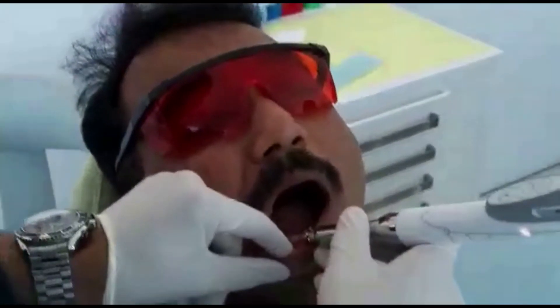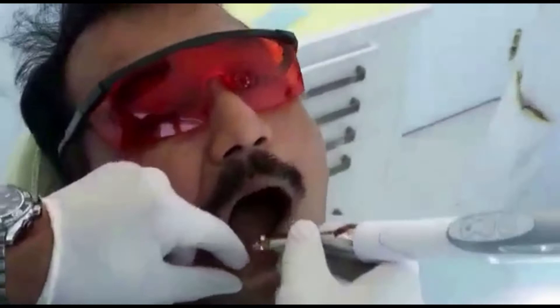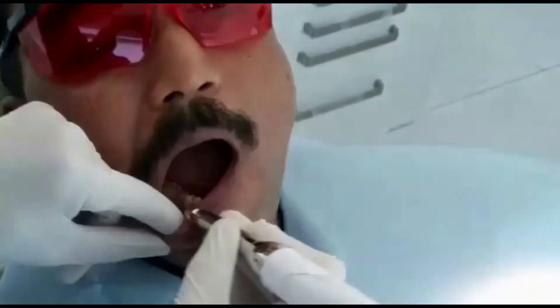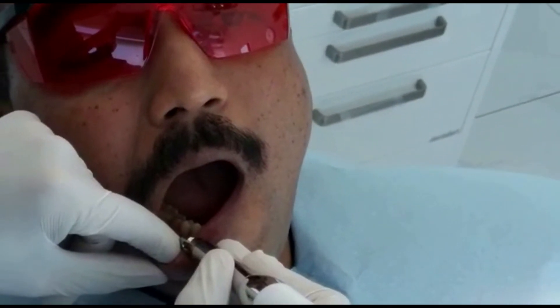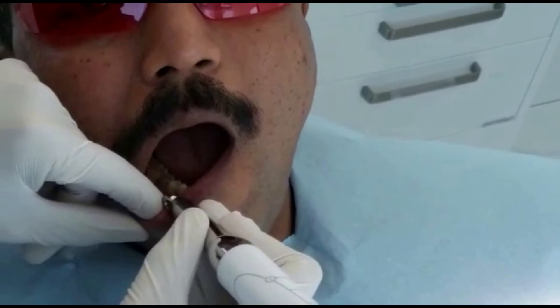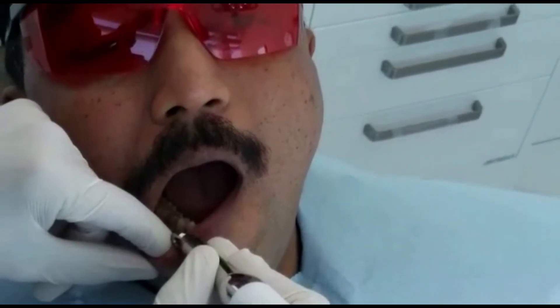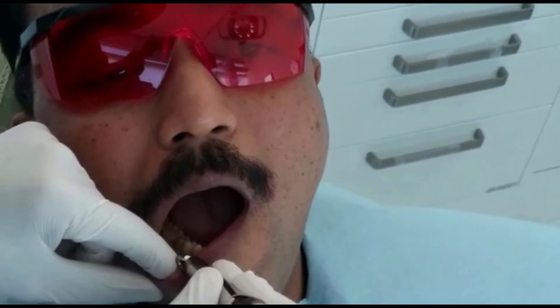I'll put the marker here so it will give me a shot. I'll make sure it's into our series. And... that's it. I can see blanching.